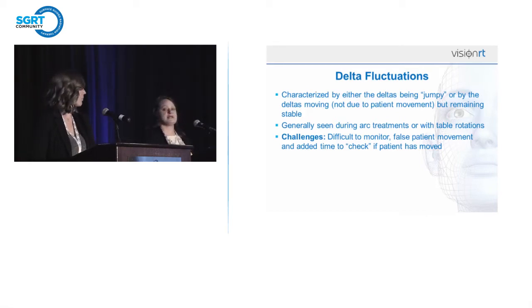So one of the things that was discussed, I believe in a couple of the talks, was the region of interest on SRS cases, making that mask big enough. We like to say 2 cm above the brow line and the tragus of the ear is great for opening and for drawing that ROI.